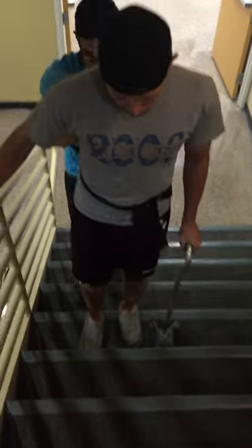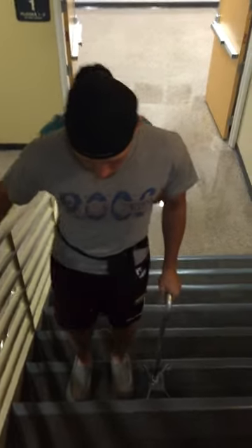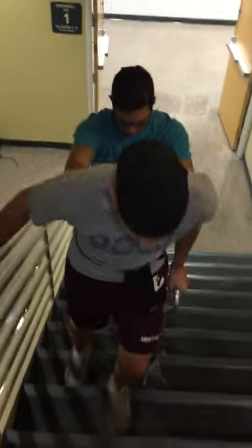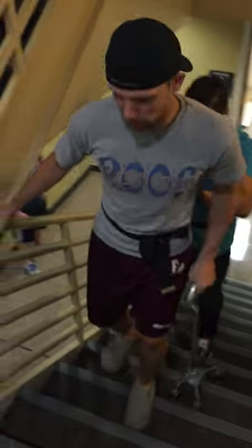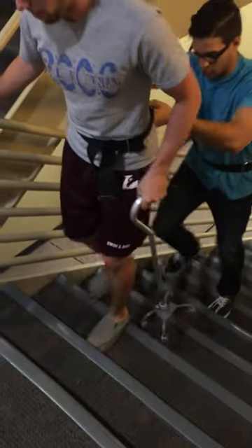How are we feeling? Good — this is more tiring than walking without a cane. I agree. Is that handrail giving you some support as well? Yeah, it is.